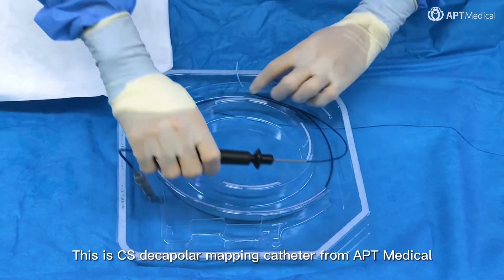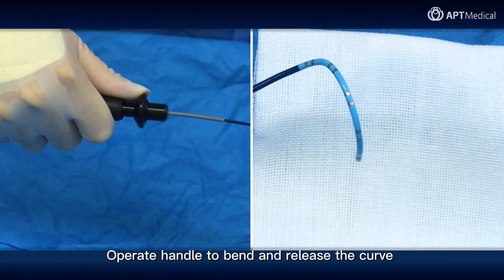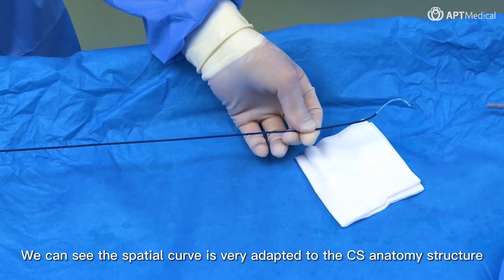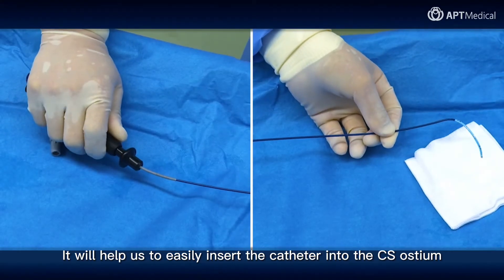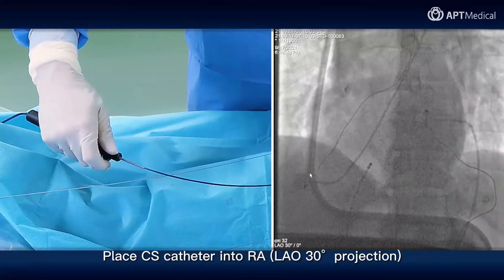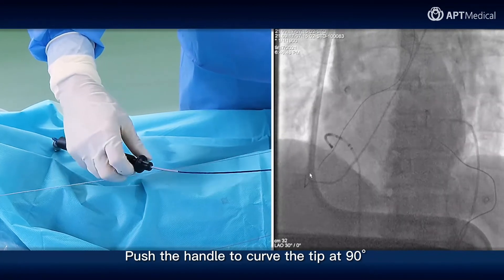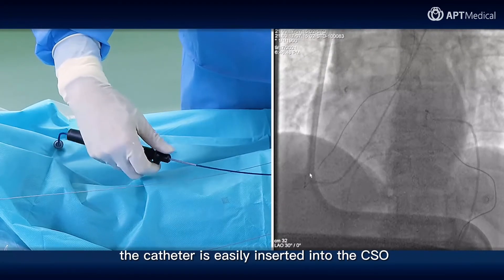This is the CS decapolar mapping catheter from APT Medical. Operate the handle to bend and release the curve. We can see the spatial curve is very well adapted to the CS anatomy structure — it will help us to easily insert the catheter into the CS ostium. Place the CS catheter in the LAO 30-degree projection. Push the handle to curve the tip at 90 degrees, then rotate the handle clockwise. The catheter is easily inserted into the CSO.